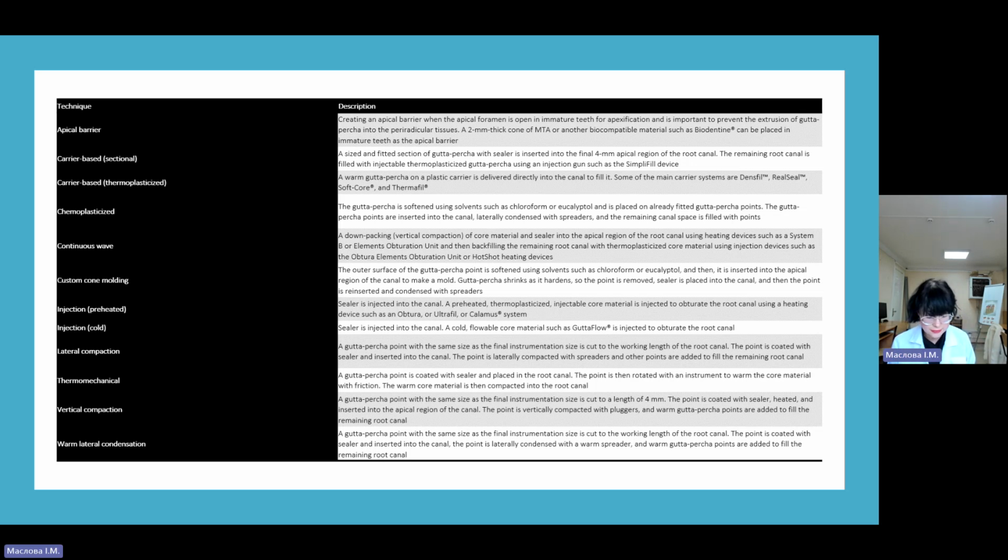HCSC sealers feature a hydration setting reaction and have a hydraulic nature, representing a minor shift in the chemistry of the sealer types. They are mostly based on tricalcium or dicalcium silicate, and their main characteristic is the formation of calcium hydroxide when in contact with water.